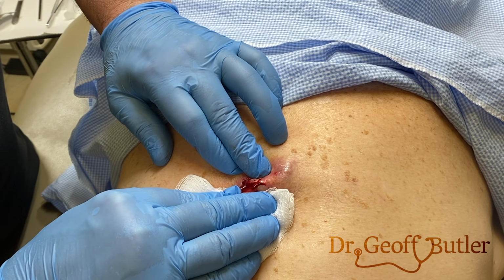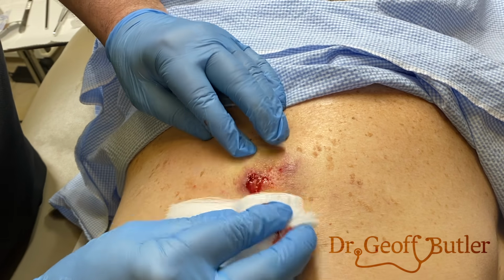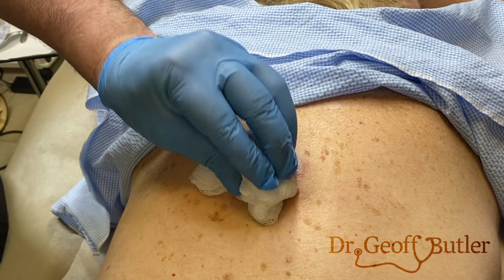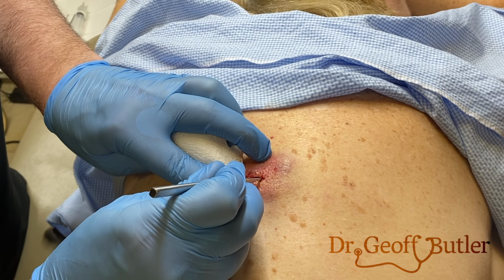I'm almost done with this portion. Now once I've done that, I'm going to use a curette, and if she tolerates, I'm going to see if we can break down adhesions. You okay when I do that? Mm-hmm.